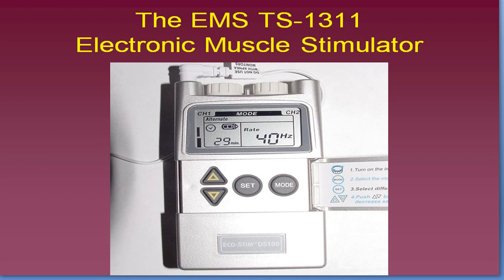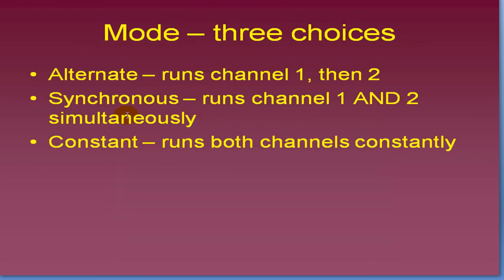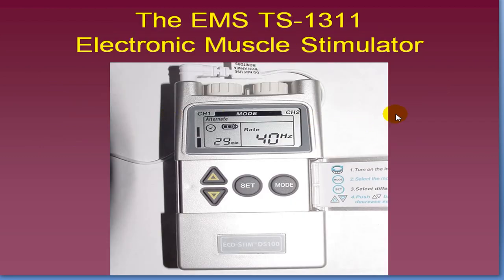And you're going to have those on what mode? They're going to be on synchronous. So both are going to come on at the same time. Channel 1 is going to come on and channel 2 at the same time. So what we're going to get is nice elbow extension combined with wrist and finger extension. So we'll have our stretch out and our drop at the same time.